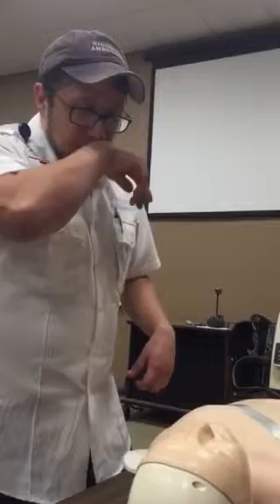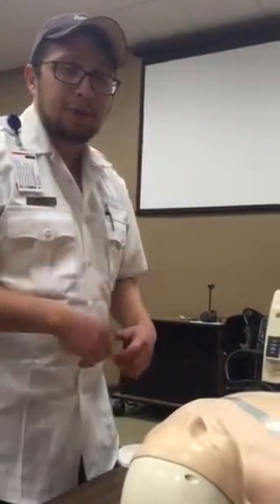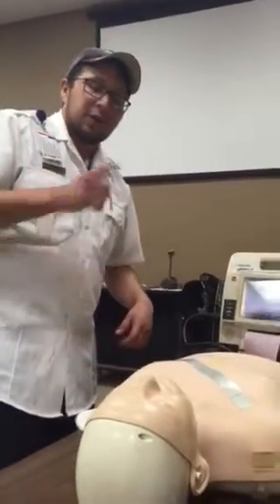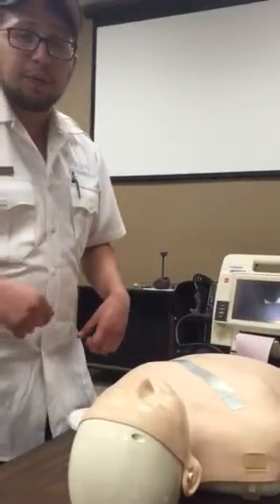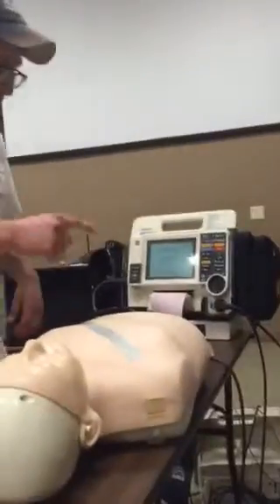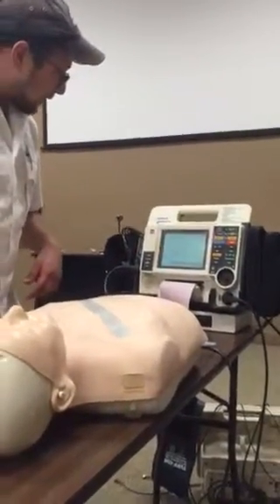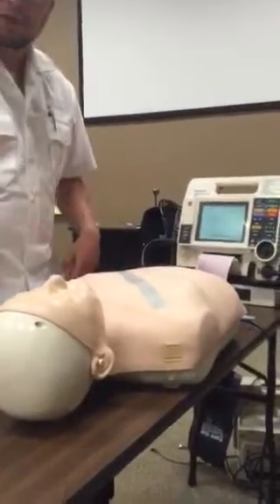Okay, so I'm going to go ahead and give her 4 baby aspirins orally, 81 milligrams for each tablet. I'm going to have her chew those up. And then I'm going to go ahead and give her 1 tablet of nitro sublingually, 0.4 milligrams. And I'm going to go ahead and turn on my monitor, check out your 12 lead there. So it looks like she's in sinus with bigeminy. I gave her the nitro. How's she feeling after the nitro?